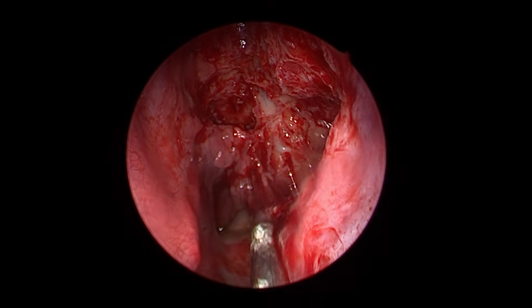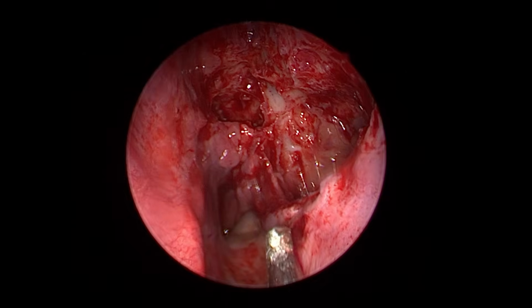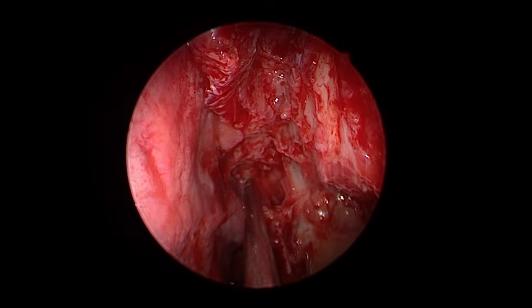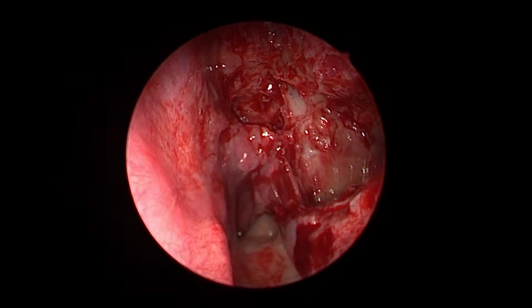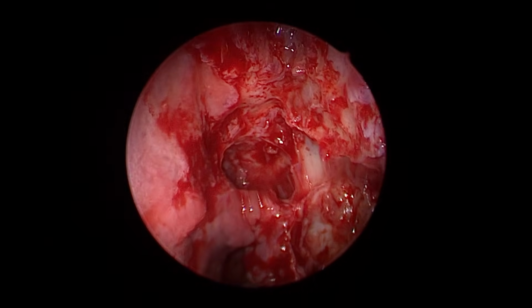See, we have not infiltrated at all, just using only topical application. And this is the picture at the end. Just train your patient how to make sure the steroid reaches. That's the only thing left now for his treatment. Thank you so much for your attention.